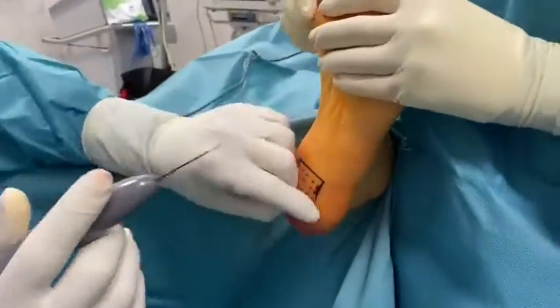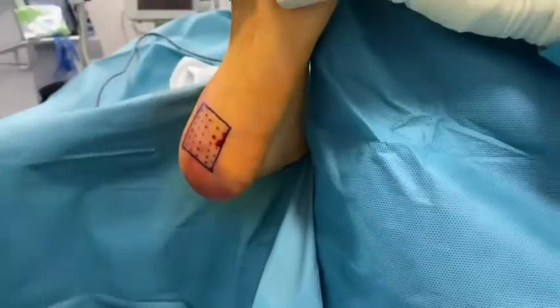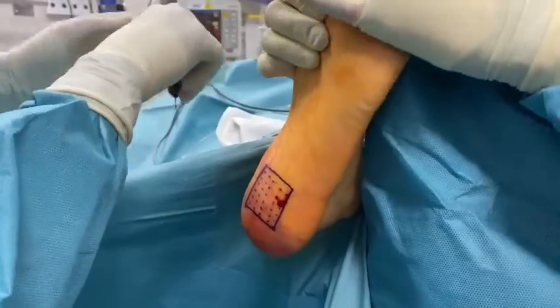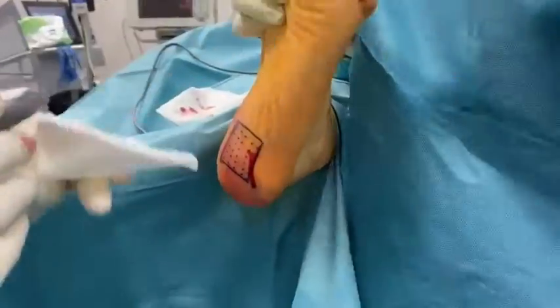The Topaz microdebrider is connected to the console and attached to a sterile saline drip, setting at a drip rate of 1 drop every 2 seconds. The console must be set in position number 4.